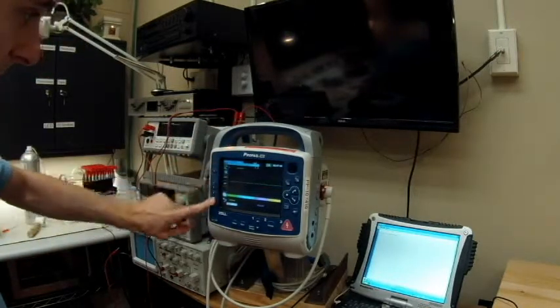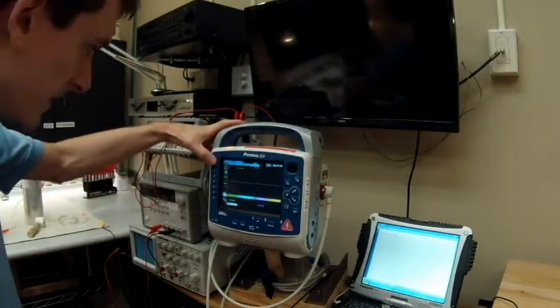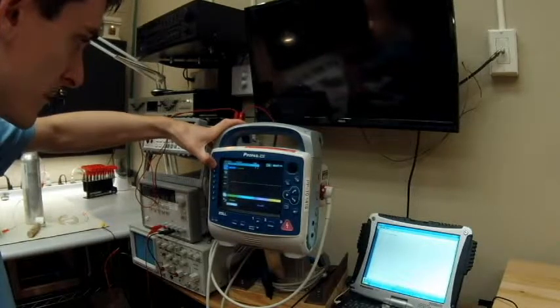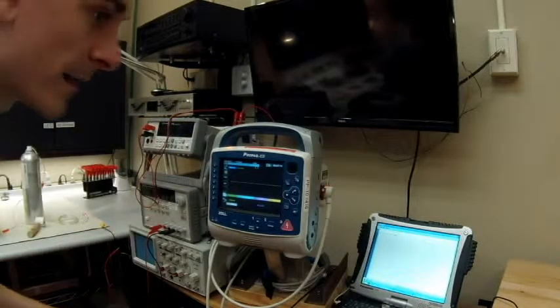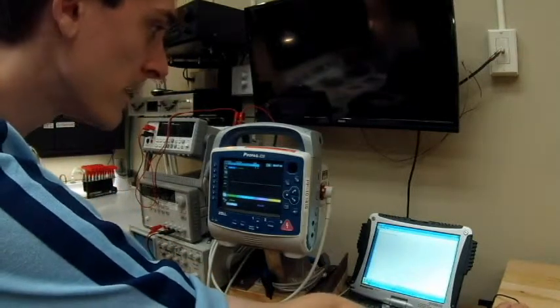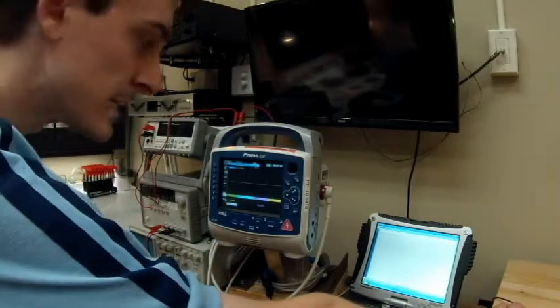At the very top soft key we have the ability to change the leads. We are in lead two right now. We're going to change through leads I, II, III, AVR, AVL, AVF, V1 through V6, and then pads — that's what we want. We're going to input a 60-beat-per-minute, one-millivolt ECG signal.